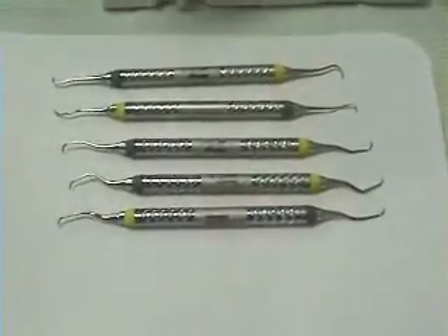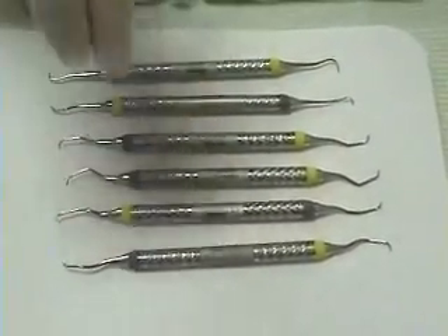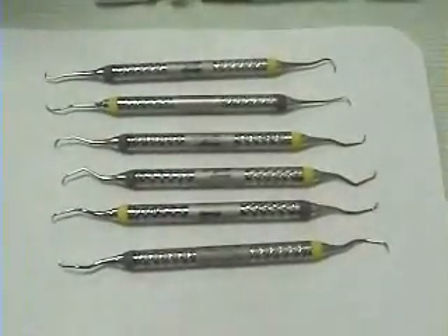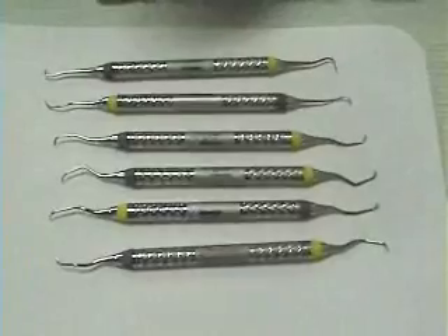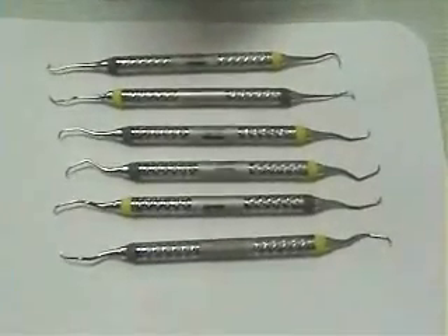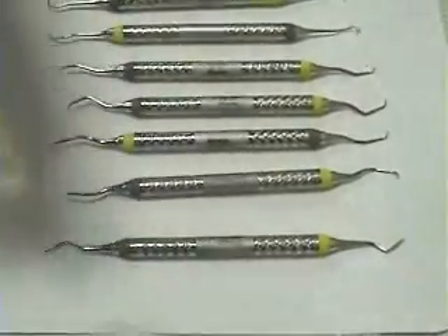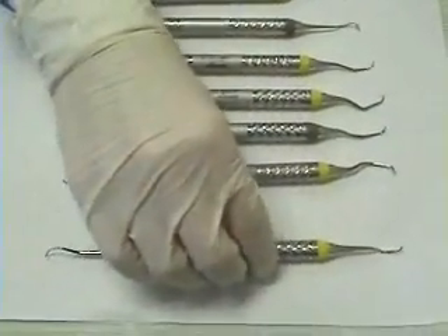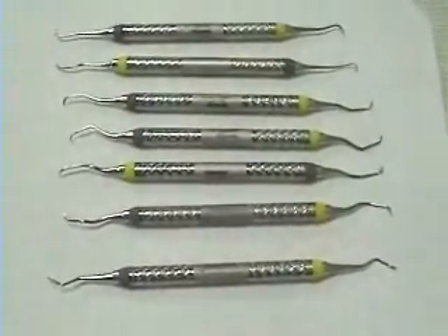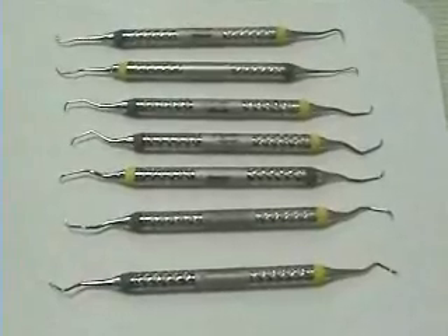The next instrument is the Gracey 13-14, used from the distal line angle into the distal. The last instrument is the Barnard 5-6. It is a universal with two cutting edges on each side. Make sure to review the design characteristics of each of these instruments as you go through this practice session.